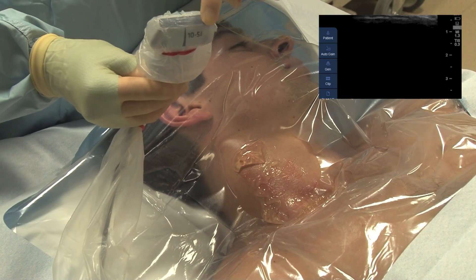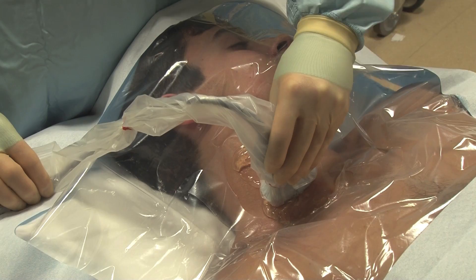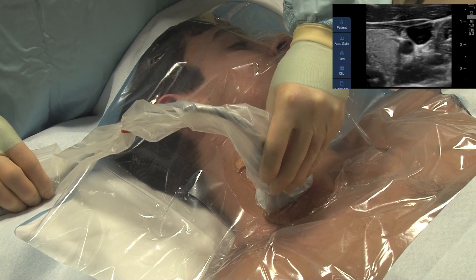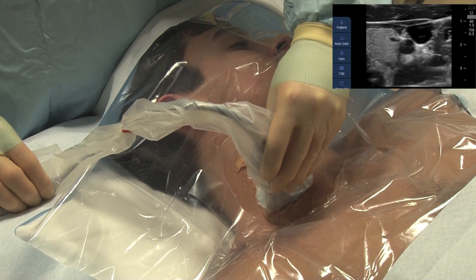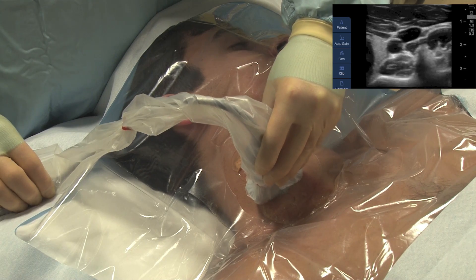Orient the ultrasound probe by touching the probe while watching the monitor. Identify both the artery and the vein in the same ultrasound image. Note that in this video, the ultrasound appears reversed because of the angle of the camera.